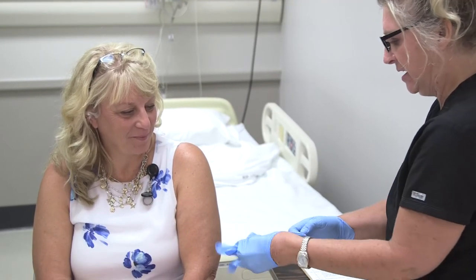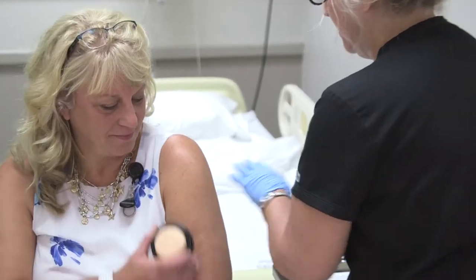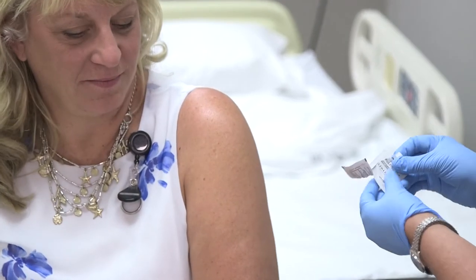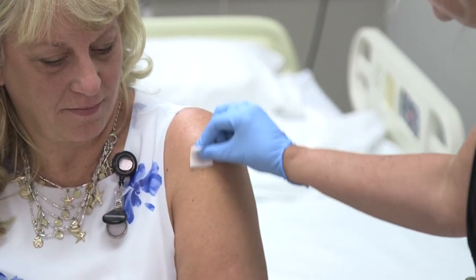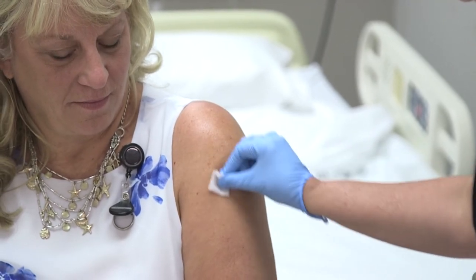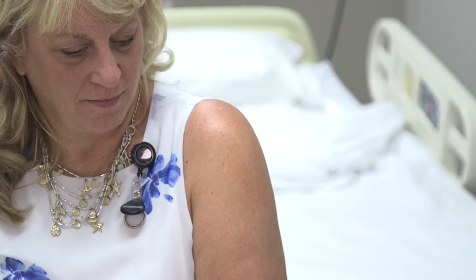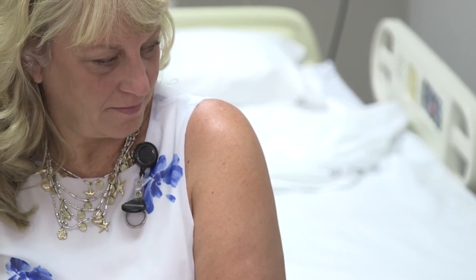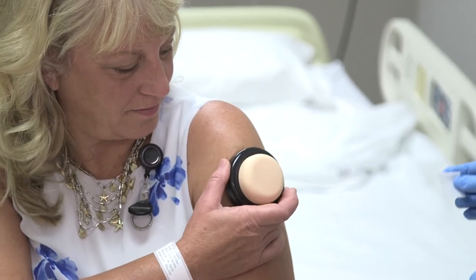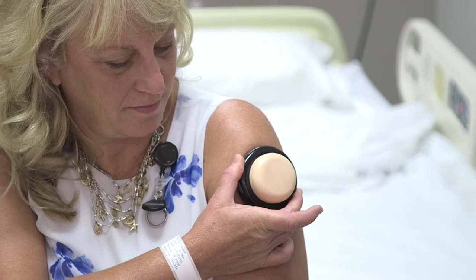Okay, so we can go ahead and we're just going to clean the area off. So you can put that up there again. Or I could show them how to do it. Yeah, I'll show you how to do it. So we know that it's going to be right approximately here. So you're going to go in a circular motion. Okay, I'm going to do about 10 to 15 seconds of that. You want to let that dry. All right. So we can go ahead and put that on there.